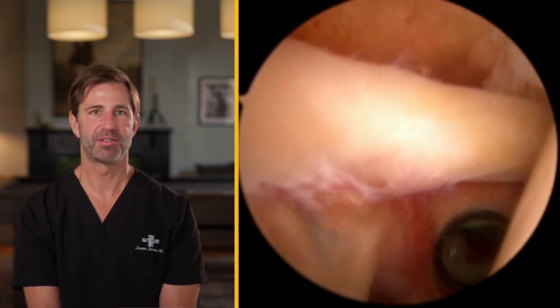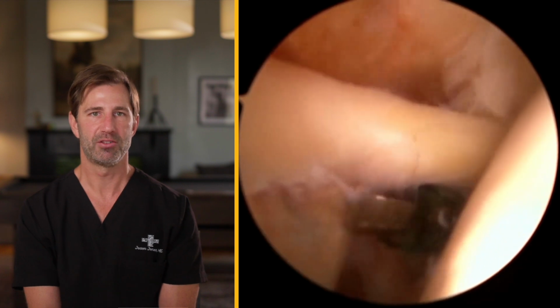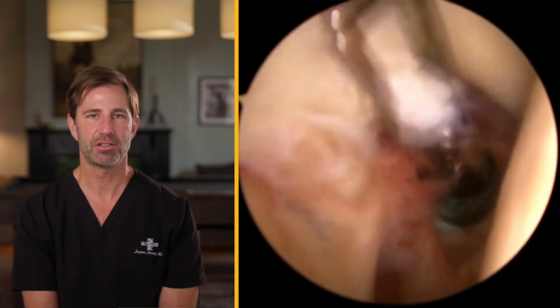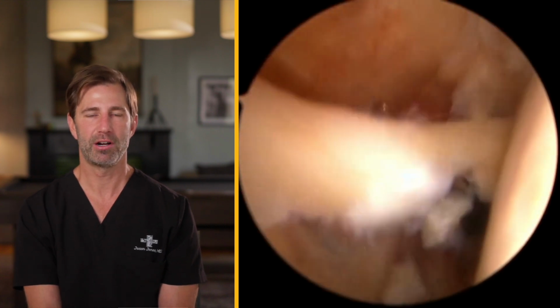The biceps is the small structure at the top of the shoulder. This is the long head of the biceps, and it's one of two tendinous attachments to the biceps itself. This is entering the shoulder and attaching to the superior labrum itself. We will cut this for later tenodesis later on in the case.